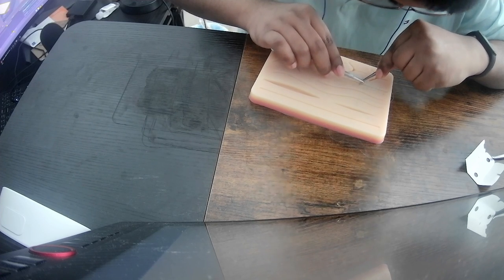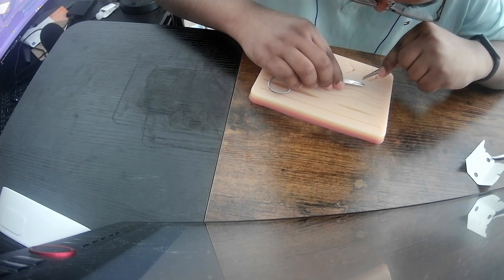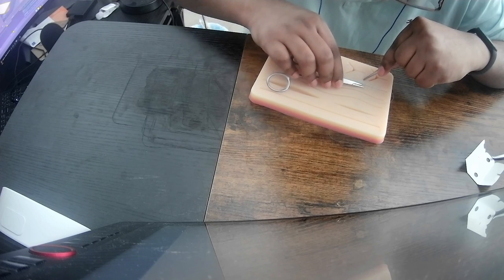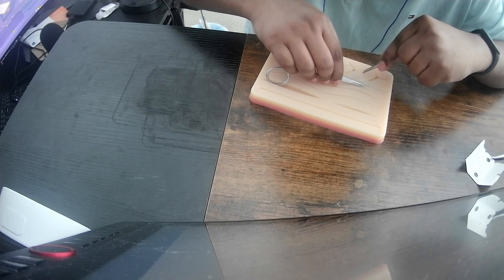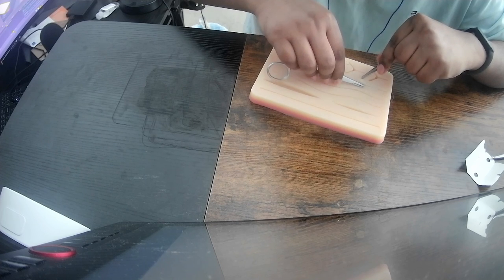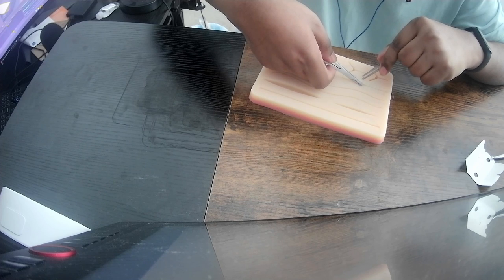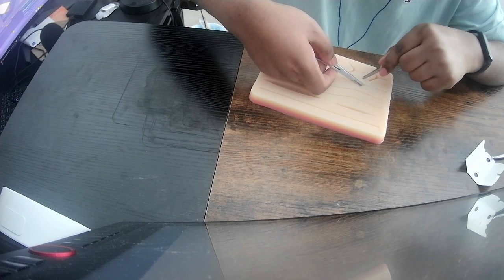Let's try. Let's see my depth. Here, maybe? Come on. Where's the needle? I don't see it. Oh, shit, I went too far. Okay. I don't think this one is a good one. Yeah, I'm not very good at doing it in two goes, I guess, because it messes up the depth. Ideally, you want to bisect the wound equally on both sides.